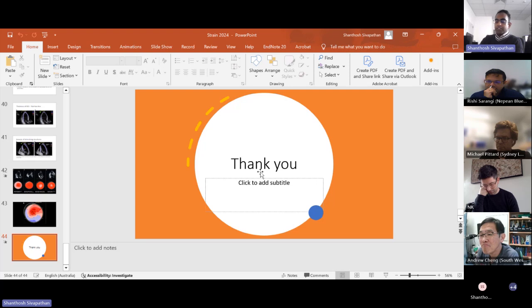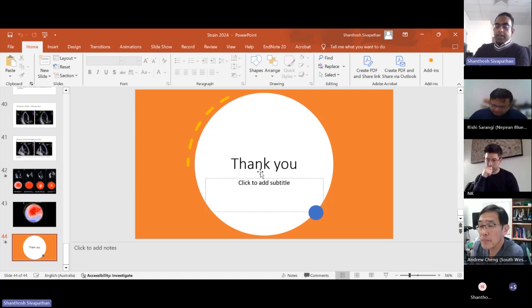Yeah, it's a good question. It's my project on this, so I'm looking into GLS in the septic population or septic cardiomyopathy. When we talk about septic cardiomyopathy, a lot of the papers have based their definition or assessment on Simpson's biplane or EF, and they've also looked at RV dysfunction.